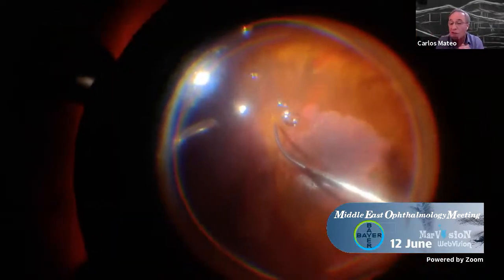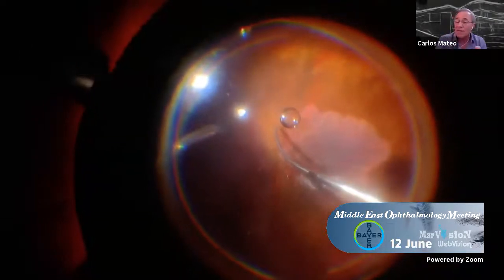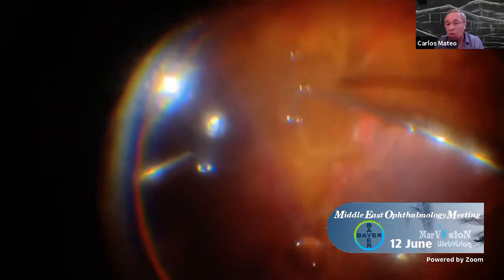Then, as you can see, when you move this, all the blood comes into the vitreous cavity. This is terrible. You spend 15 to 20 minutes without seeing anything. Look at this, the atrophy, when you remove everything, you remove the membrane, and then we are going to perform the patch of the choroid and the RPE. We perform laser first around the graft. Then we perform diathermy, and then we cut just to make this small graft to be transplanted in the foveal area.